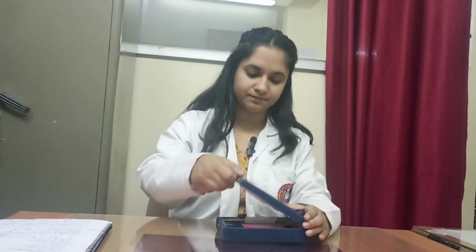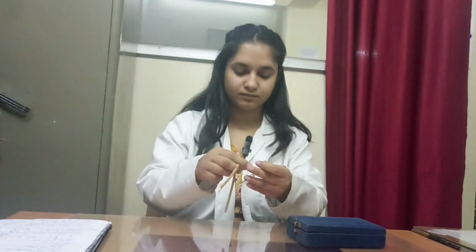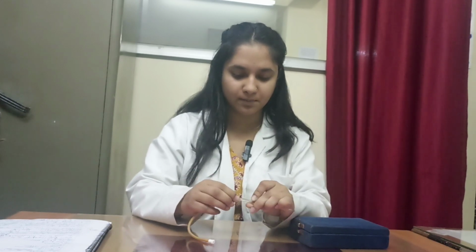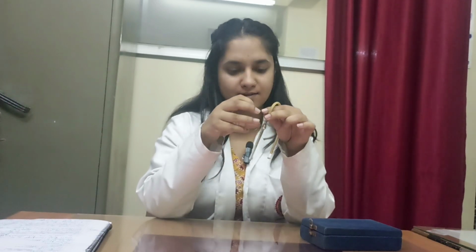Then second one is the identification of the WBC pipette. How will we identify the WBC pipette? There are some identification marks on the WBC pipettes. The bulb of the WBC pipette is smaller as compared to the RBC pipette.